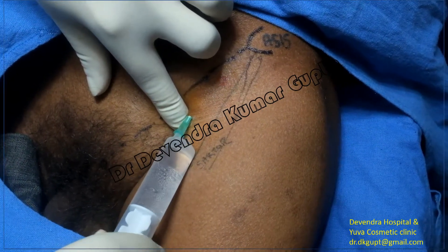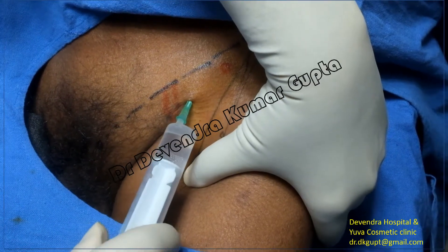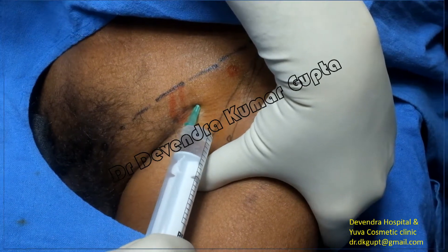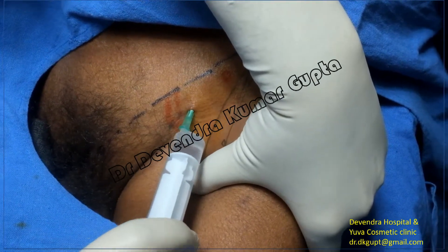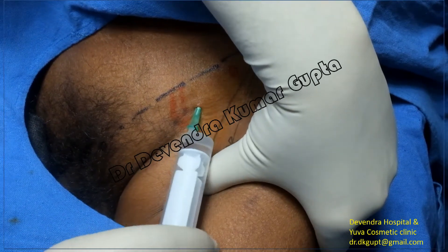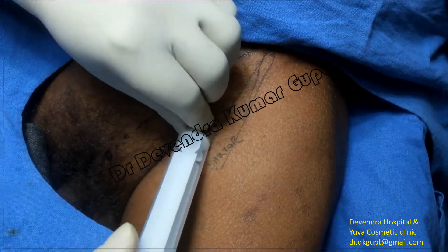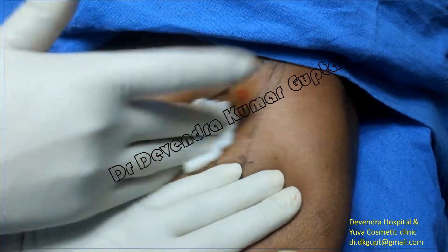Always aspirate before injection. Turn the bevel down, aspirate — there is no blood — then gradually inject, aspirate, and rotate the syringe to avoid accidental intravascular injection. Apply distal pressure and inject. Now this block is complete; check for free flow — yes, it is there.